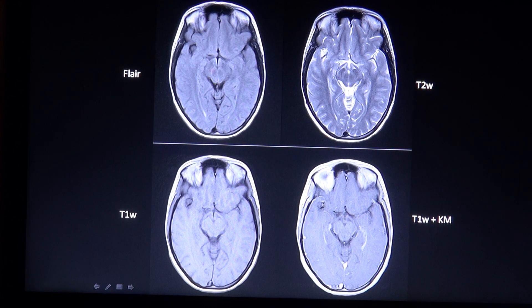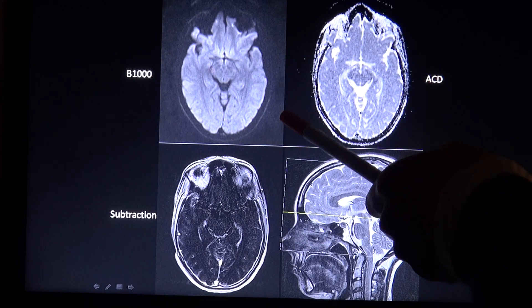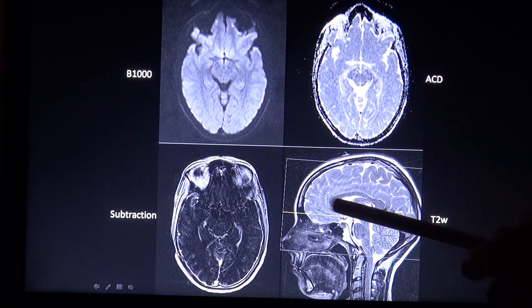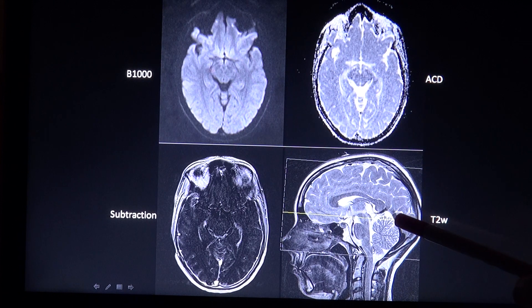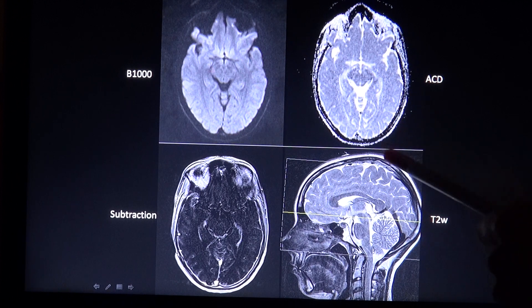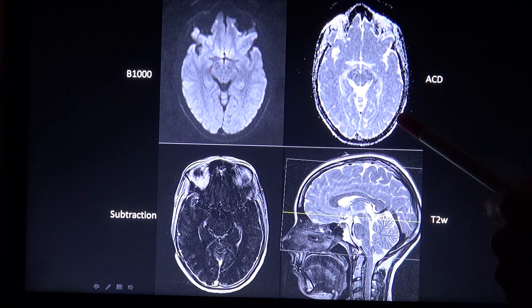Last but certainly not least, I want to mention the diffusion-weighted image, or DWI, which is seen here. This sequence consists of three images: one with the so-called low B value, one with a high B value, and the ADC map, also called the apparent diffusion coefficient map.